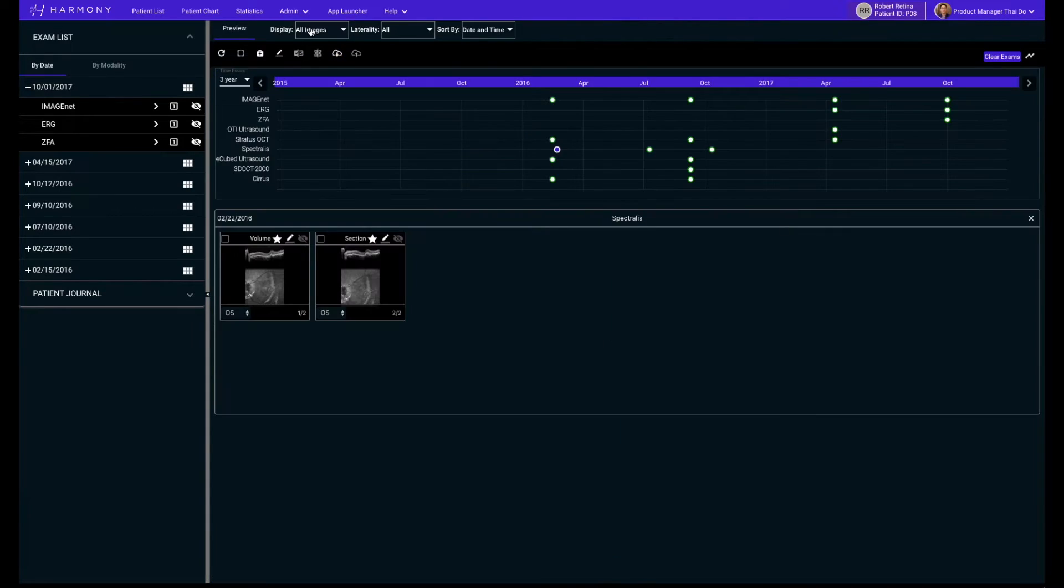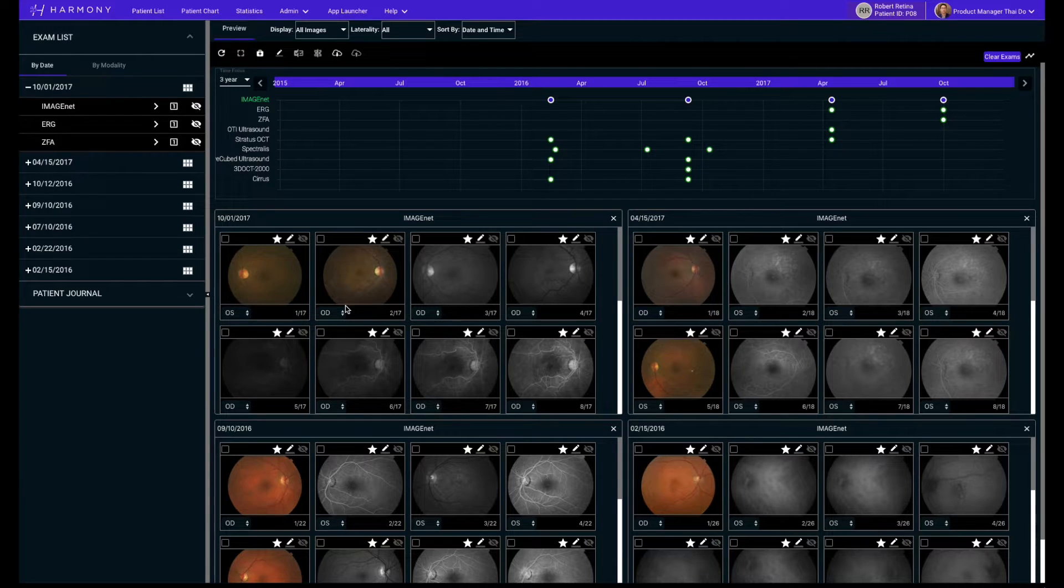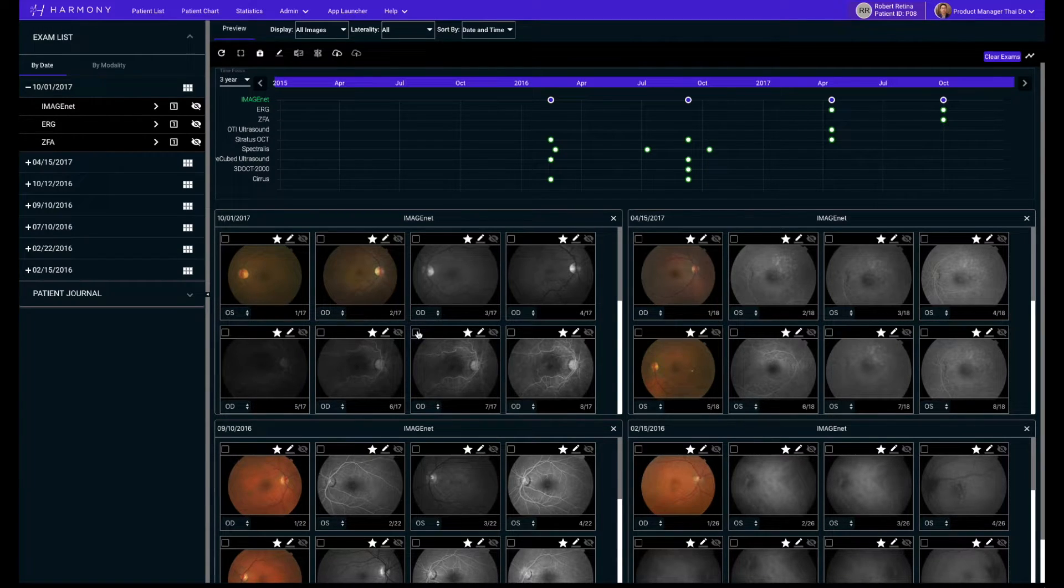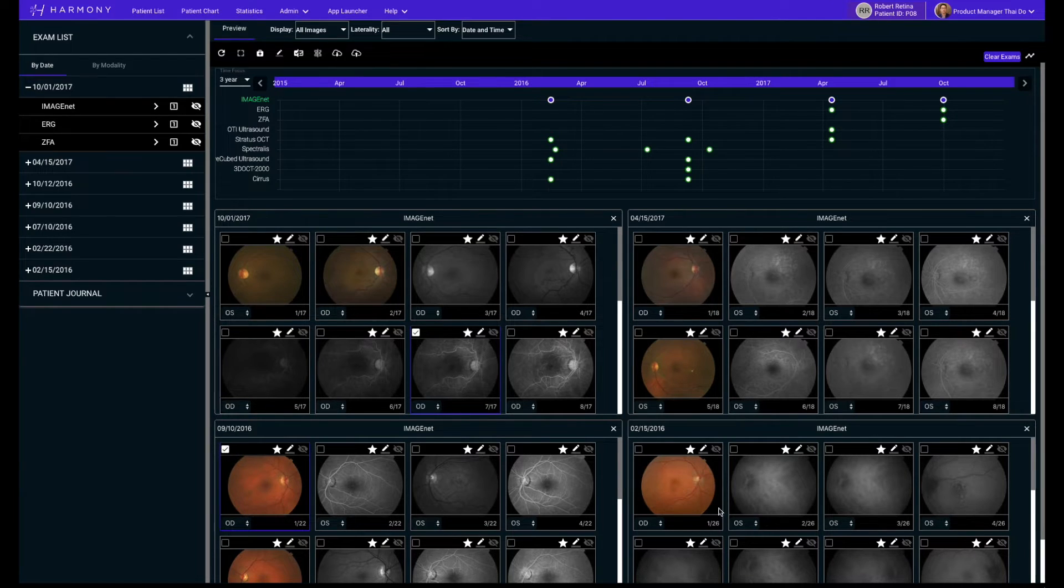One of Harmony's strengths is the ability to easily compare multiple images simultaneously. All you have to do is check the box for any image of interest and then press the compare selected button.